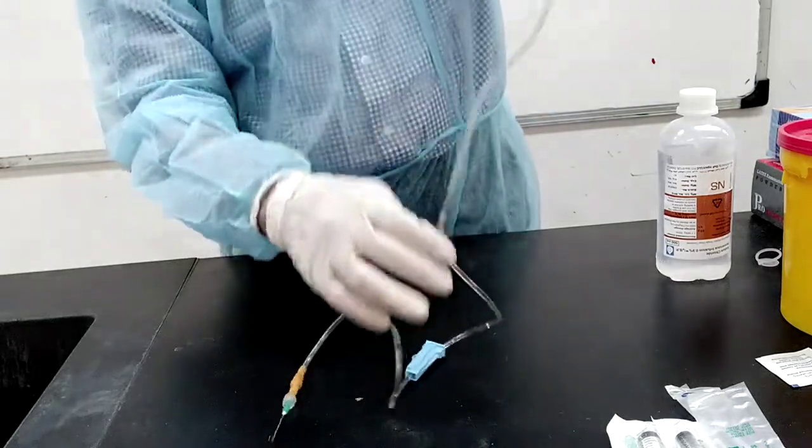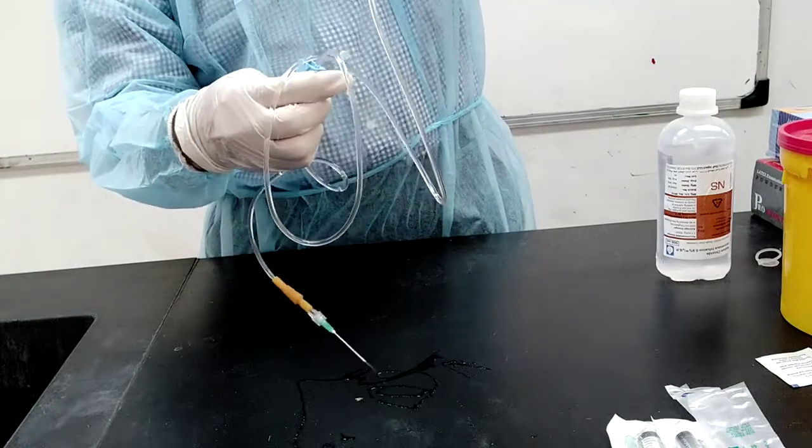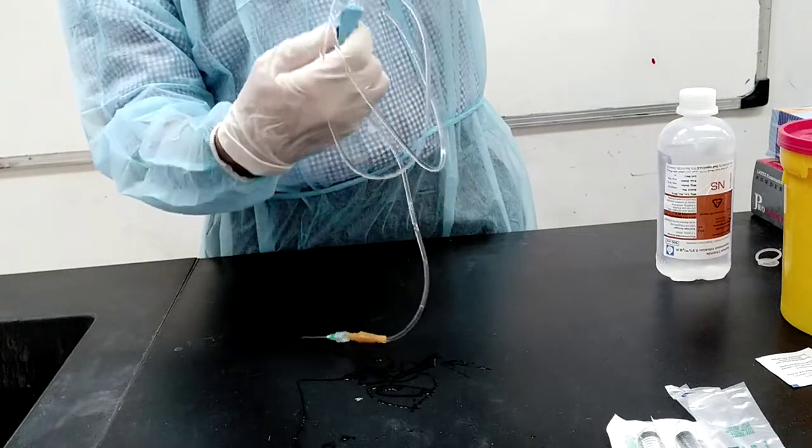According to gravity, we can control the drainage using the clamp. To stop the drainage now, or to increase the drainage, as you can see.